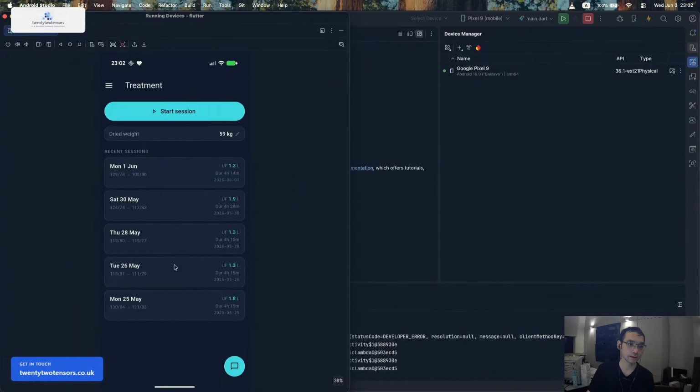Right now everything is on API, but I need to convert it to a tool format so the AI can use it. So let's see how we can do it.